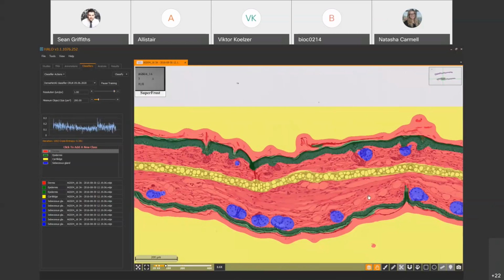Thanks. No worries. I'm just writing down your comment about nuclear compartment or cytoplasm as well. I think it's just the nucleus it looks at, but I will double check.